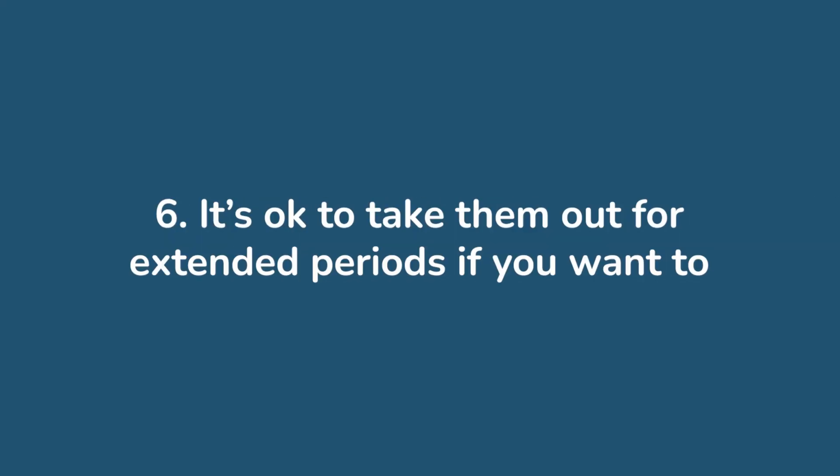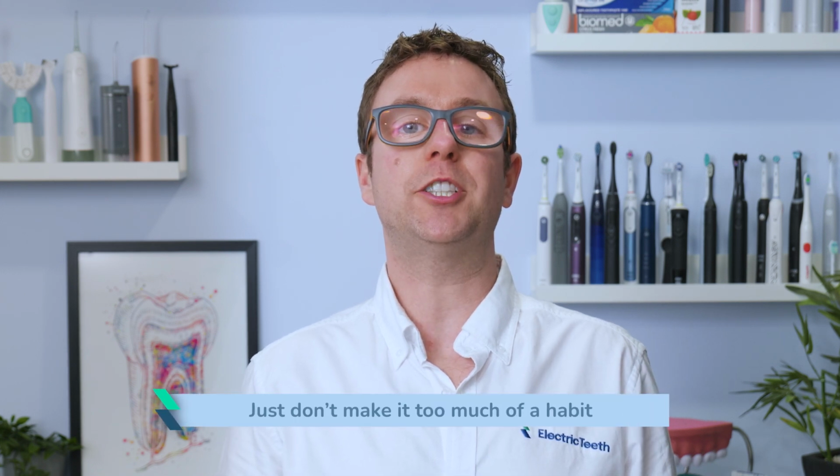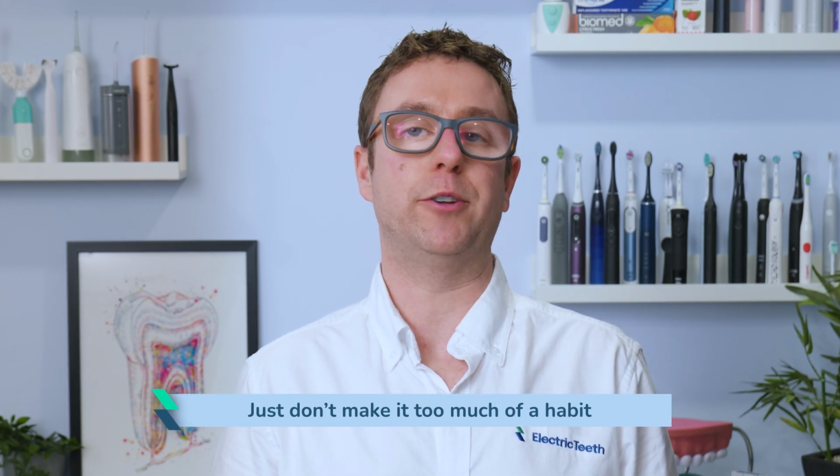Number 6. It's okay to take them out for extended periods if you want to. If you have a special event to go to, or you're going out with your friends for drinks, it's best to take them out and have a few hours of freedom. Just don't make it too much of a habit, as it will delay your treatment.